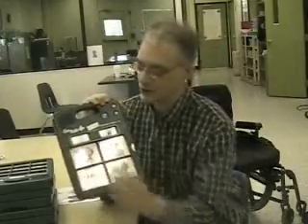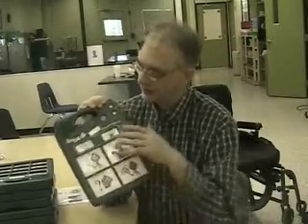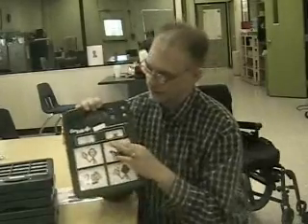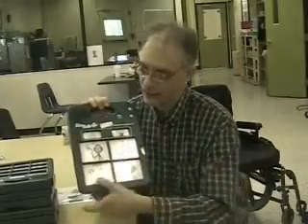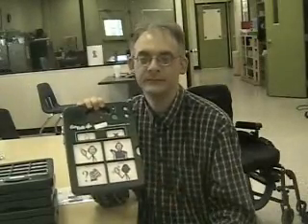Now you see that I pushed it once to record, and then push it again to stop. And then after I push this back button, this red light goes out. I'm fine. And it just repeats what I just said. How are you? Goodbye. And that's just the basic operation of a GoTalk.